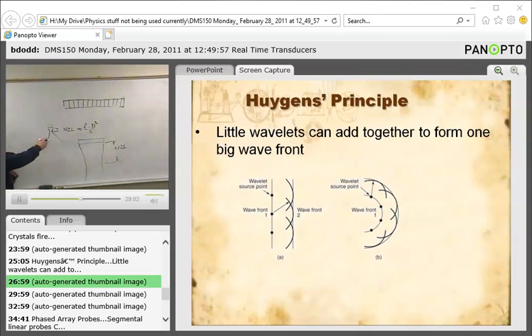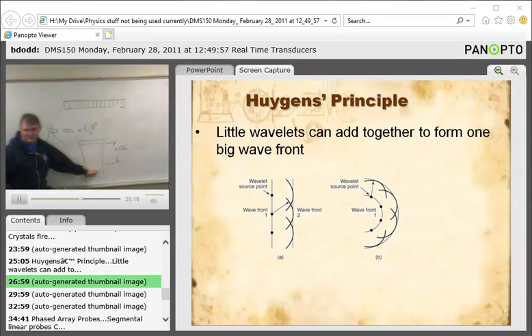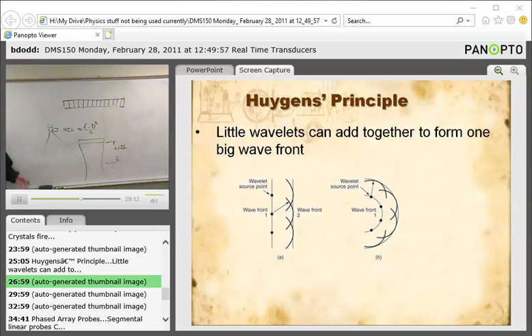Now, this one has really good lateral resolution for about 1 centimeter. This one has mediocre lateral resolution, but for many centimeters. So it's kind of a trade-off there, whether we want really good superficial structures or we want deeper structures, because we had to make our beam wider, but this one starts widening out quicker. All right, so we know that we can control the focal zone depth by controlling the diameter of the crystal.